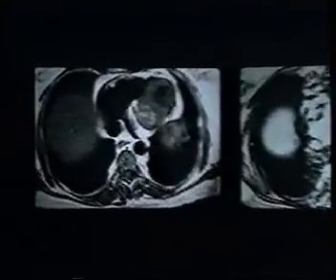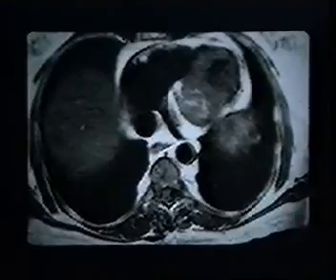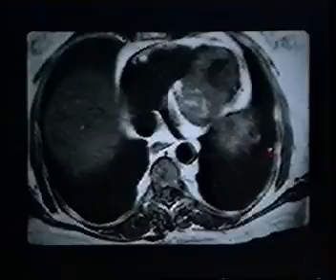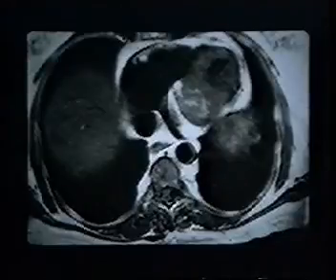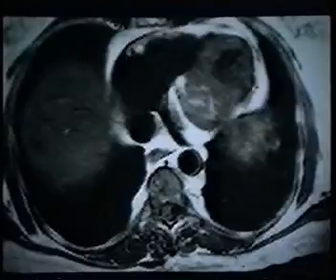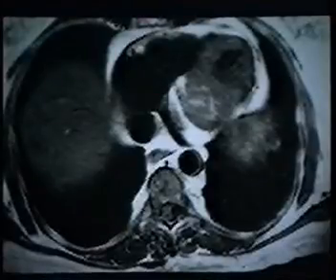Now, how do we get around the problem of looking at these vascular lesions in the lung? As I suggested already on spin echo images, this can be problematic, and I show you this is a different case, of an AVM in the periphery of the lung. And unless I was using this pointer to outline this lesion right here, I sincerely doubt any of us would actually identify that. Signal void in an AVM surrounded by the signal void of lung, as we've already suggested for sequestrations. And for scimitar can be a problem. The way to solve this is to use gradient refocused echoes. These are very sensitive to the presence of flowing blood, and what is a non-diagnostic image here becomes immediately diagnostic. You can see all this signal, bright signal, originating from this peripheral AVM. And I think this is an informative slide, therefore.